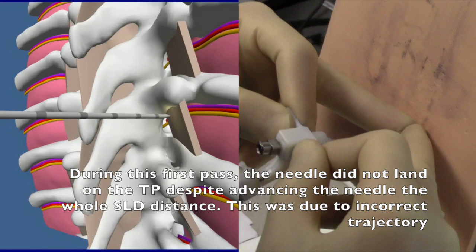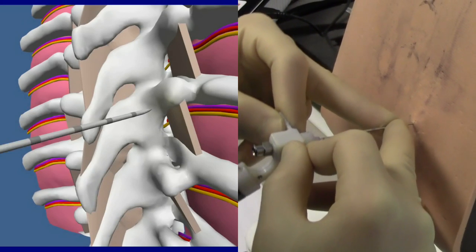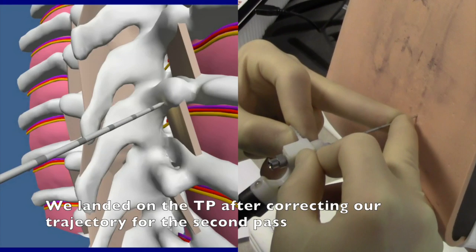During this first pass, the needle did not land on the TP despite advancing the needle the whole SLD distance. This was due to incorrect trajectory. We landed on the TP after correcting our trajectory for the second pass.